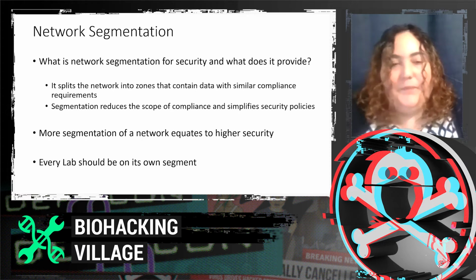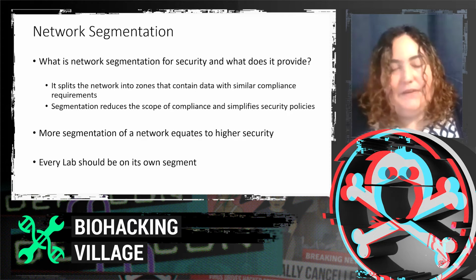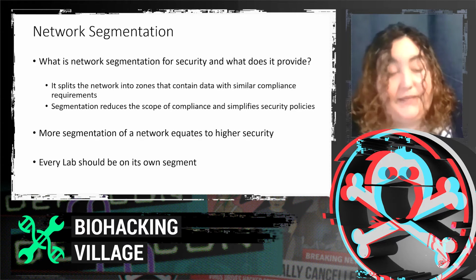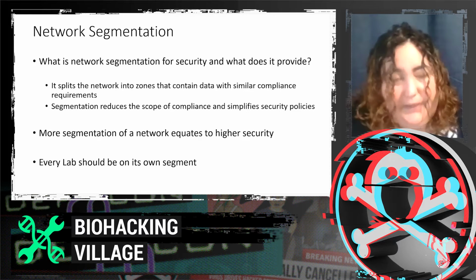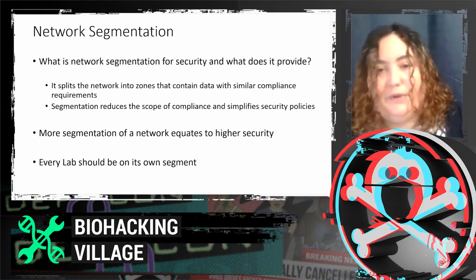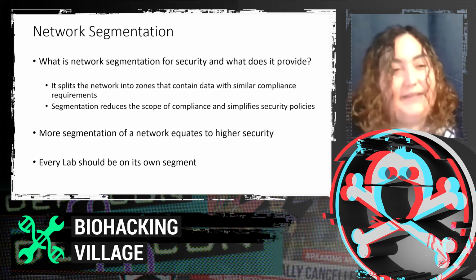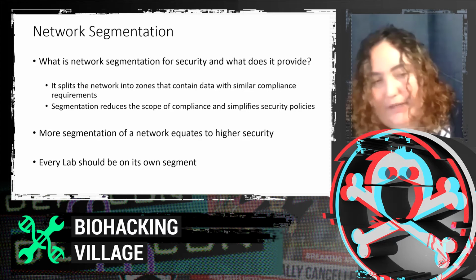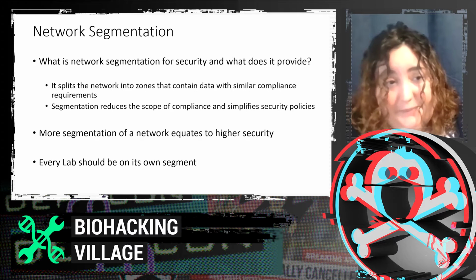That's what you have even if you just have one firewall or one area of protection. If you create a bunch of smaller network segments, even if one area is compromised, the other areas can remain protected.